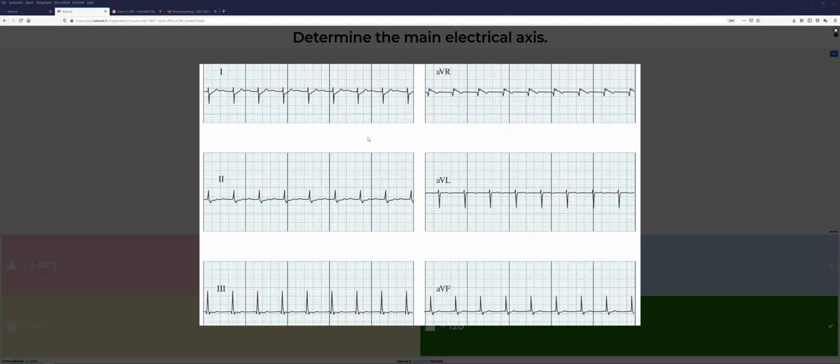120, this is one. And on the other side, a little bit more difficult to see, because from 210 up to 270, we do have 60 degrees when we are reaching the minus 90. And another 30 degrees makes it 90. So minus 60 and 120. All right? I will show you the axis system and you will understand.